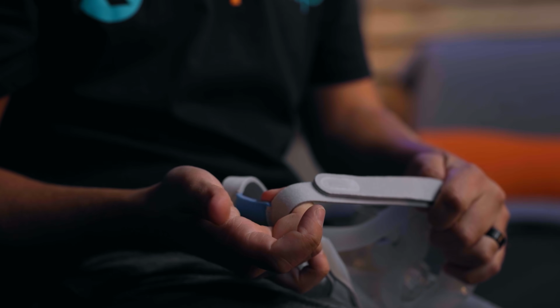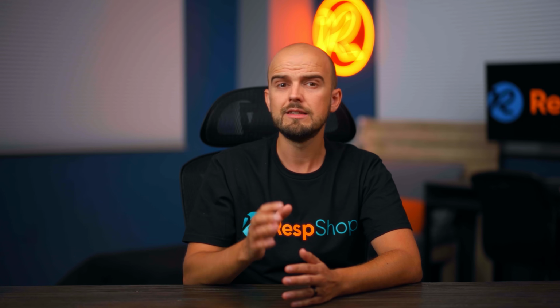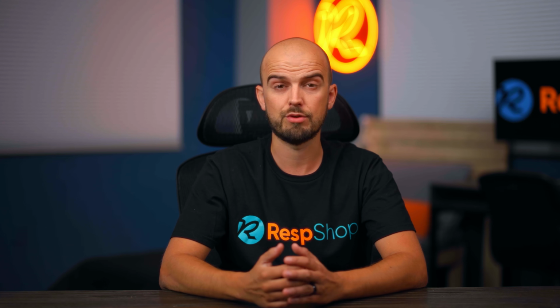I'll show you a trick for that in just a bit. You also need to make sure that the cushion is sealing well to your skin. To get a good seal, make sure your skin is free from oils.